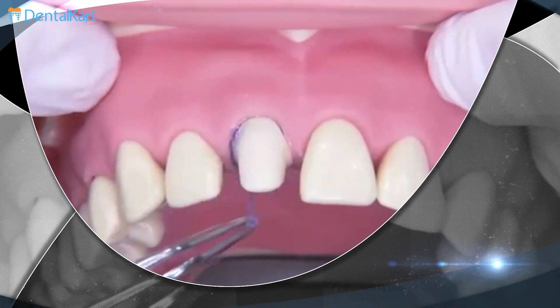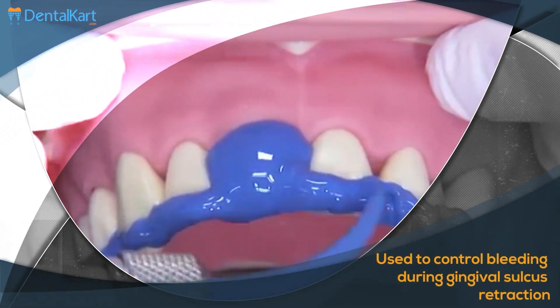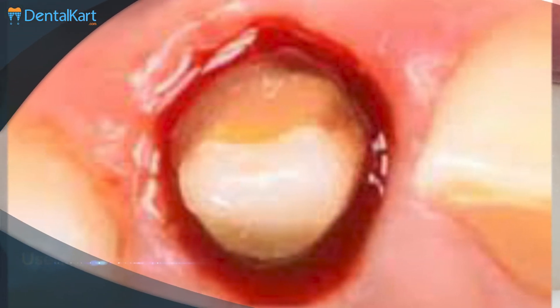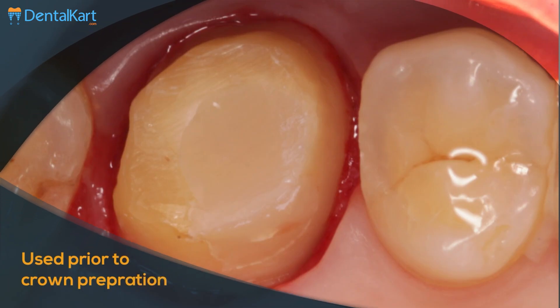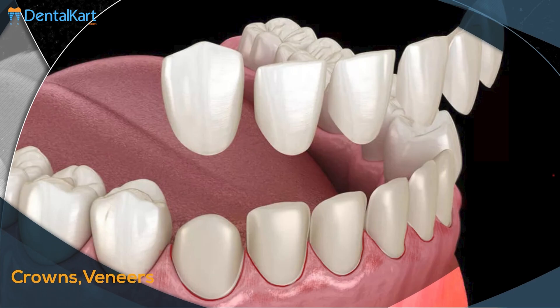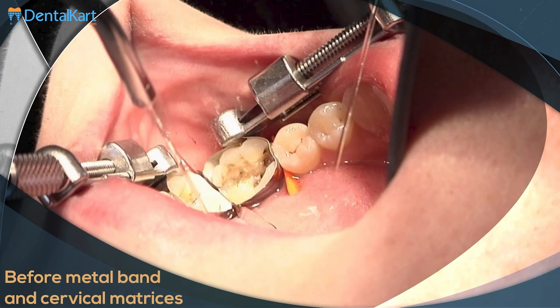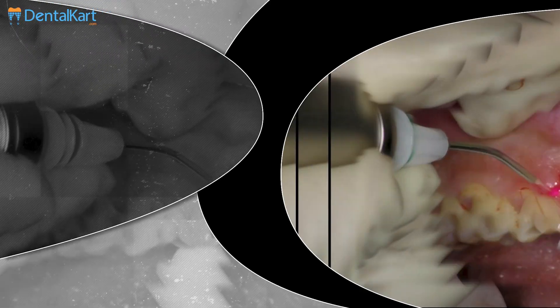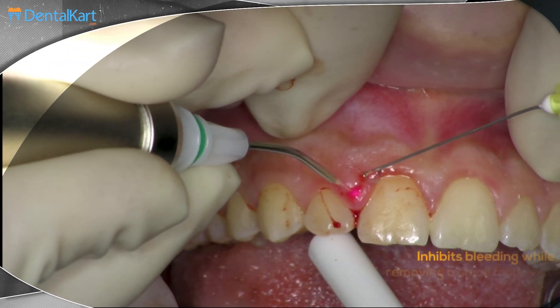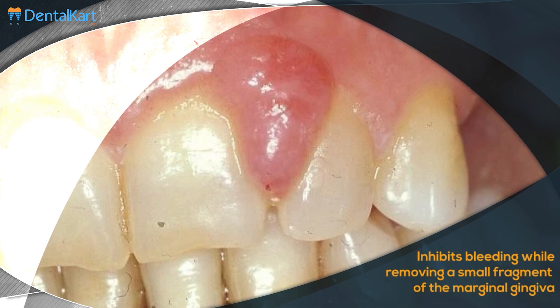It can be used to control bleeding during gingival sulcus retraction prior to impression making. It is used for controlling gingival bleeding and oozing prior to procedures like crown preparation and prosthetic restorations such as crowns, veneers, bridges, inlays, and before placement of metal bands and cervical matrices. It also inhibits bleeding while removing a small fragment of the marginal gingiva or an overgrown gingival papilla.